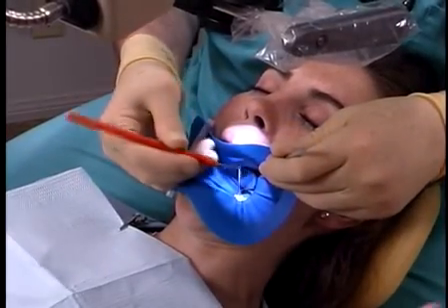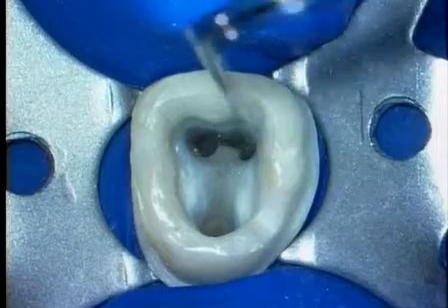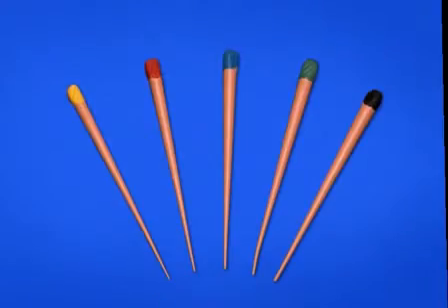Generally, 3 pluggers are pre-fit prior to packing so that the clinician knows with confidence that when a plugger meets resistance, it is on thermosoftened gutta percha and not unyielding dentinal walls. Generally, clinicians fit a fully tapered, non-standardized fine, medium, or medium master cone. Just on the market are color-coded gutta percha points that correspond to the D0 diameters of files.